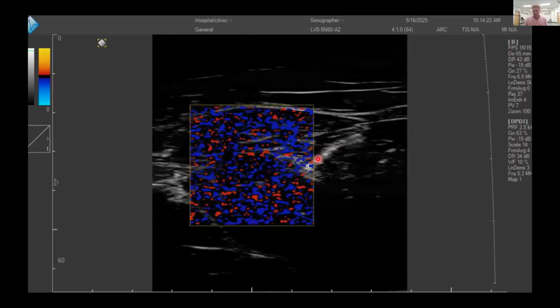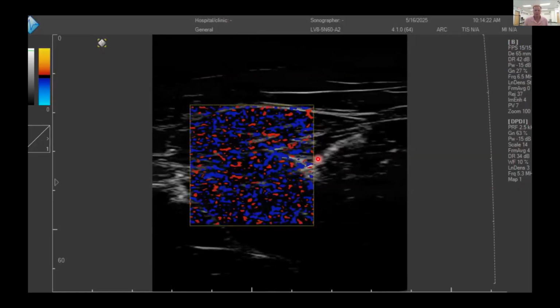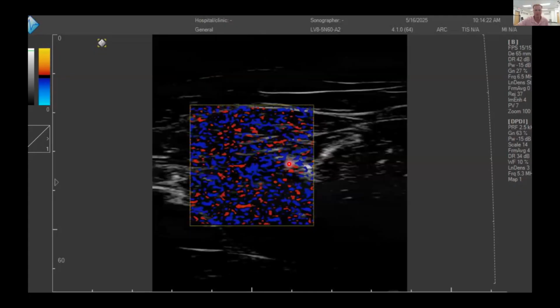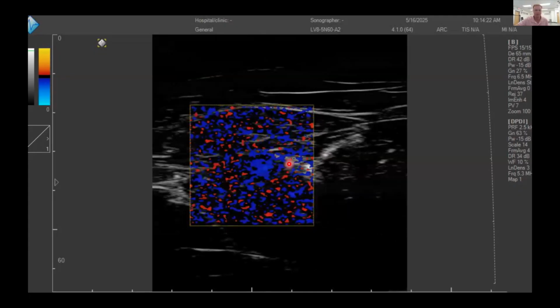And typically, when we're using ultrasound, we've got it in what's called B mode, or brightness mode, which is what we use for musculoskeletal imaging. Again, here I've got it in what's called Doppler mode, which is used for measuring blood flow.